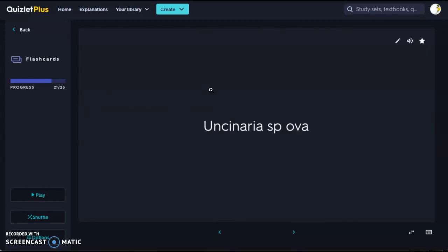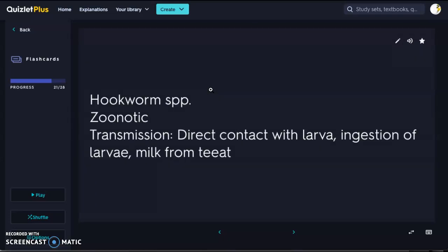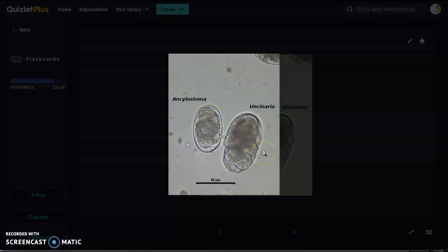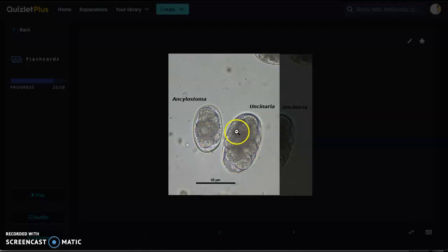Next we have a type of hookworm — the Uncinaria species. Hookworms are zoonotic; remember the hookworm looks like a hook. Transmission is direct contact with the larva, ingestion of the larva, and also through the milk in the mammary gland, so nursing infants can be infected that way. If you ingest raw milk, that's a potential route for hookworm infection. Here are two different species of eggs side by side — you can see a size difference between them, with clustered circles inside a thin outer line.